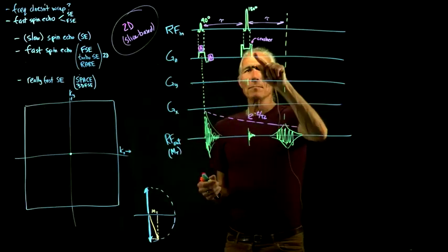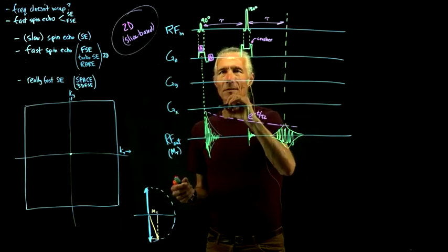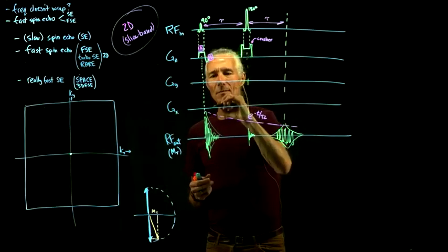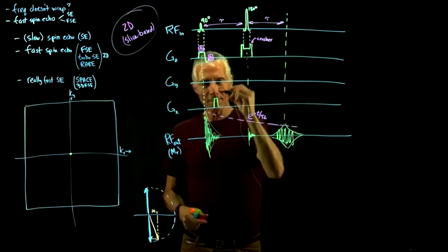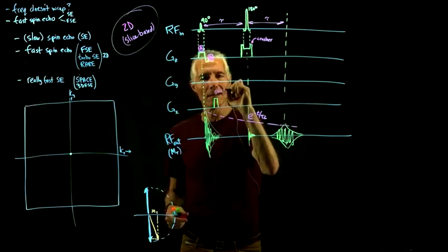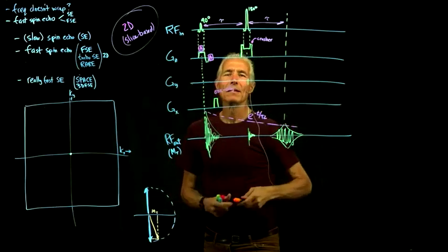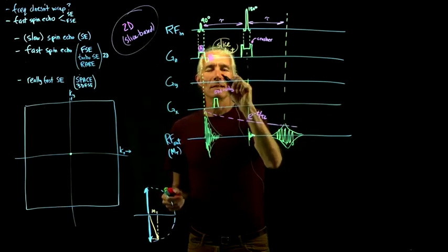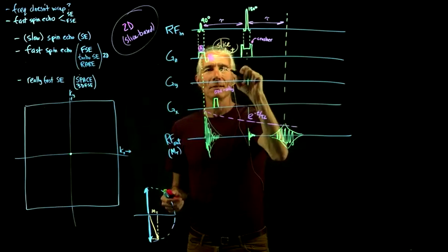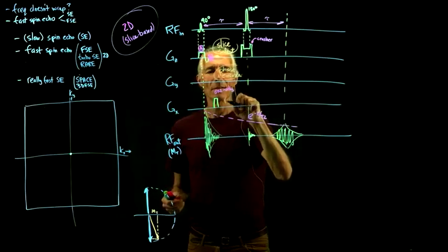So, before we do the 180, we just do one of these pulses down here on the readout. So, just do one of these, one only. And so, let's put, this is slice select, and this guy is phase encode. This guy is readout.